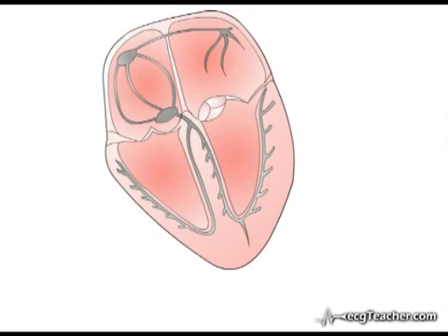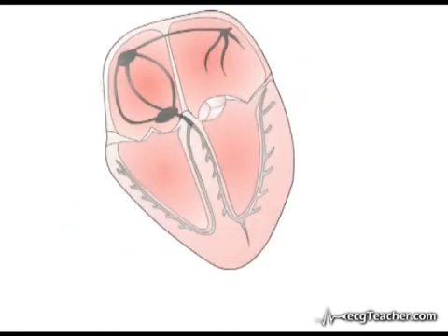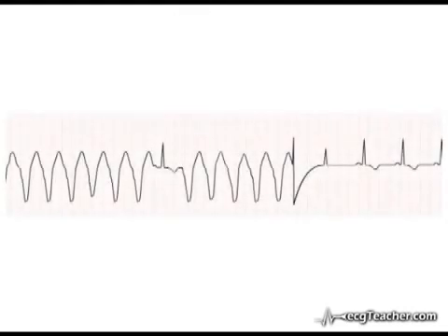We have already mentioned that it is possible for a focus situated in the supraventricular region to generate a broad complex tachycardia. This situation arises if a component of the ventricular conducting system is damaged or fails to function at higher heart rates. Distinguishing such a broad complex tachyarrhythmia from VT is a major challenge, which we will discuss in section 5.